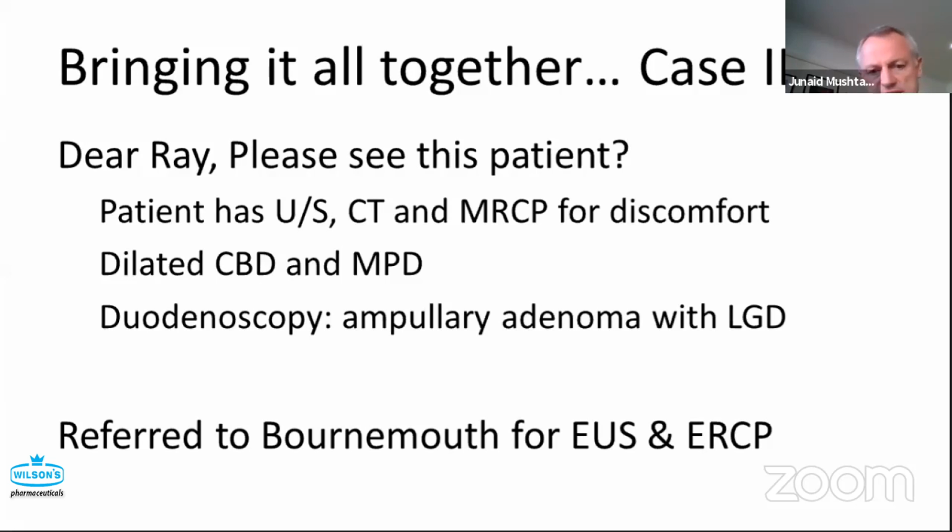It was very difficult to see the high resolution because there was a layer of mucus on the lens of the endoscope. And it was very difficult to see that single image, and it was very difficult to see actually what that image was. I think in these cases, it's mandatory that we have a look ourselves. And on that particular patient, they had, for me, a world's first of an ampullary adenoma in the major papilla and an ampullary adenoma in the minor papilla.